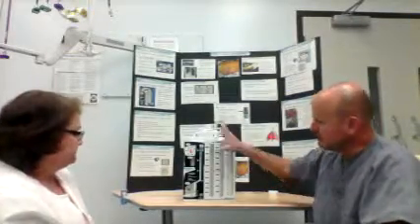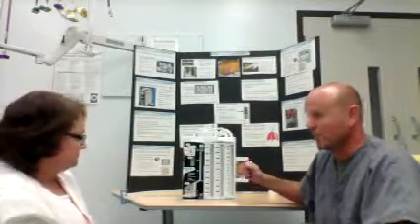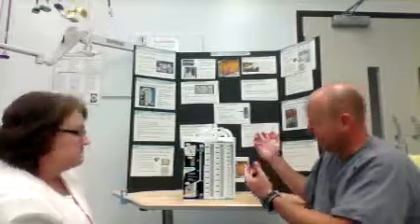Now this will come in a sterile pack. Right. So this entire unit comes sterile. So if you're in the operating room or a completely sterile environment, of course you would don your sterile gloves and open the sterile pack, and then you have a sterile field. Most of the time, however, when we insert chest tubes, it's in a non-sterile environment unless you're in the operating room.